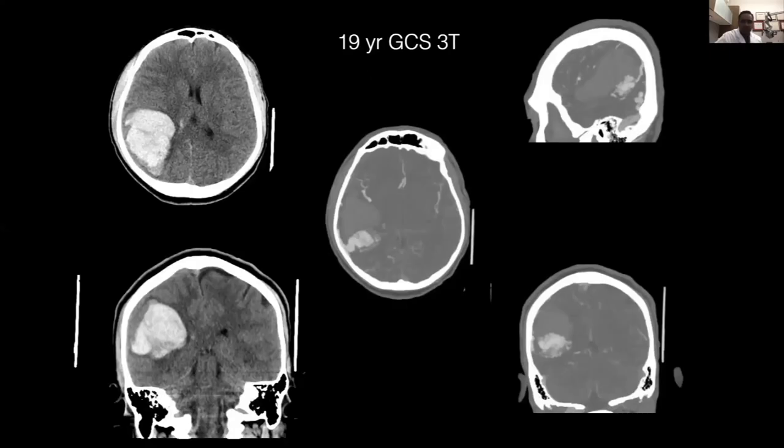Another case for good microneurosurgery is that the ruptured AVM comes to you in the middle of the night. They're young patients. You can save their life. It's a straightforward operation. You might say, oh, I'll just do the decompression and take out some blood. Yeah, you could, but you could also take it out and finish it. Or if you get into trouble and it starts to bleed too much, you can finish it. I mean, look at this guy. He did great, right?